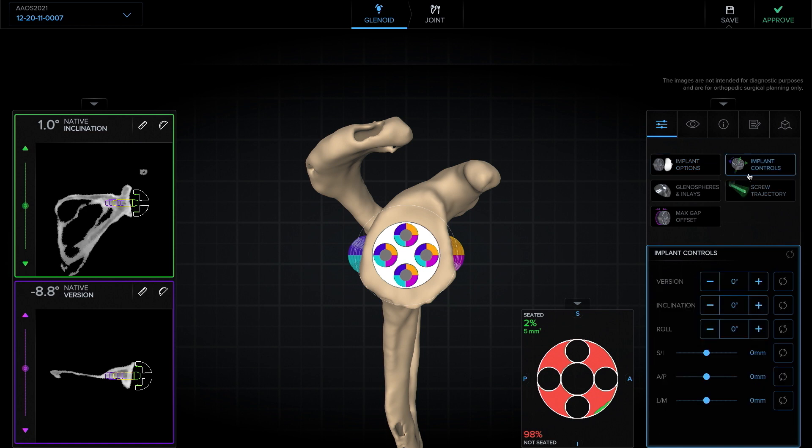Now we'll move on to implant controls. I like to start first looking at the axial. Typically, I'll leave the patients in a little bit of retroversion for several reasons. The first of which is because it does not affect clinical outcomes. The second is because a little bit of retroversion — between seven and eight degrees — for most glenoids will allow the screw to be completely contained in the vault.